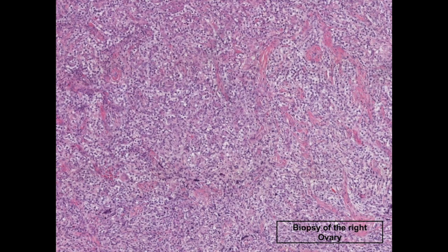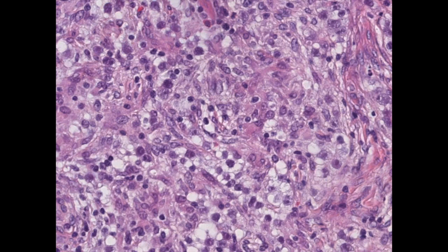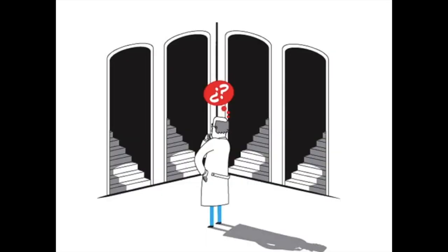In the same surgical act, a biopsy of the contralateral ovary was taken, and that showed the same pattern and the same cellularity, like here. And now, what do we do?